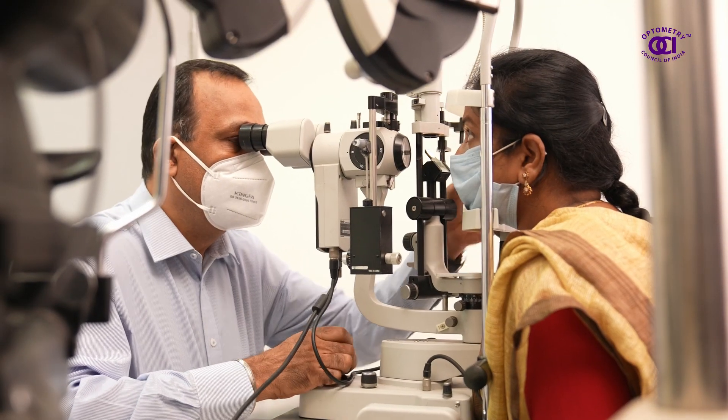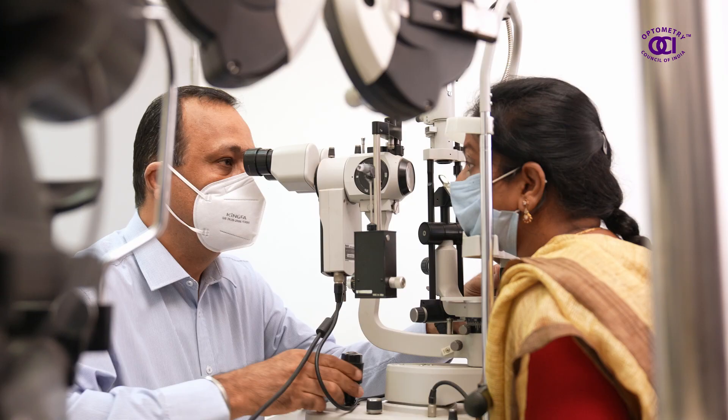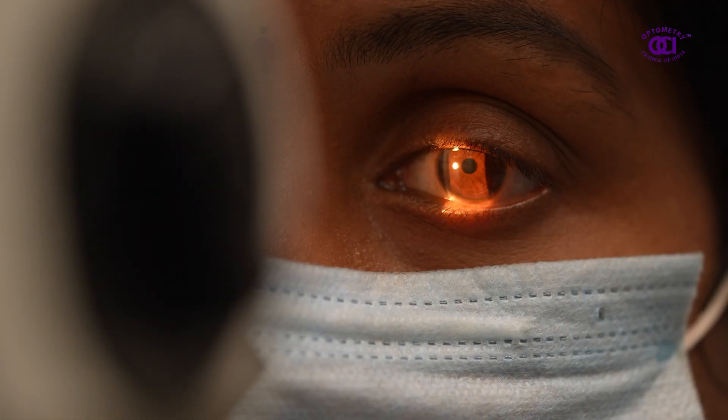Following this, the optometrist evaluates the health of the eye using the slit lamp biomicroscope, an instrument mainly used to check the structures of the front part of the eye.